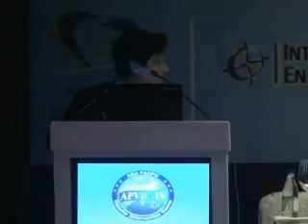So the vessel is heavily calcified. What precautions should we take and what are the limitations of the image? If the vessel is heavily calcified, first of all, good B-mode imaging is important. You have to adjust the gain settings so that you can visualize the vessel. And sometimes when you put the color in a highly calcified vessel, you may not see any color. In those particular cases, I would use pulse wave Doppler to assess the velocity and see whether the vessel is flowing or not flowing. So B-mode imaging and use of pulse wave is very important in calcified vessels.